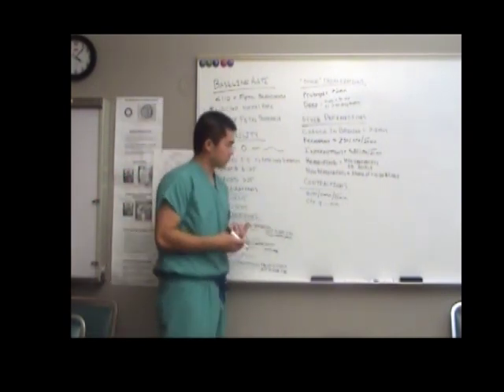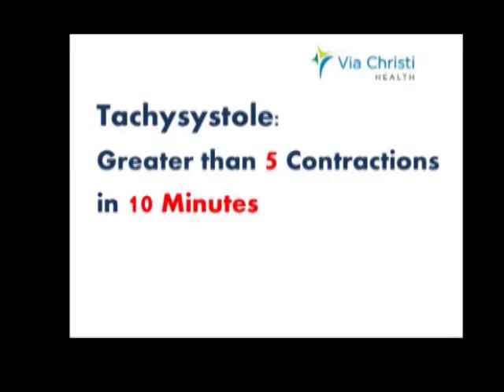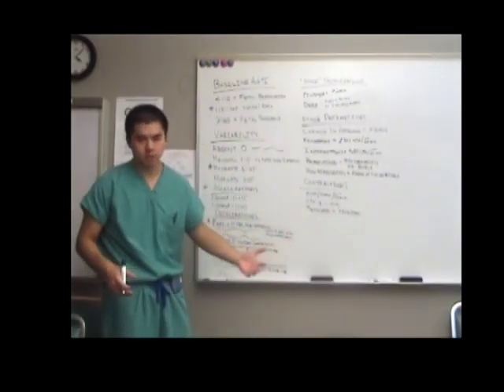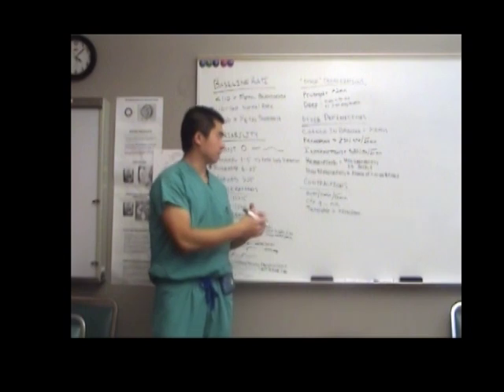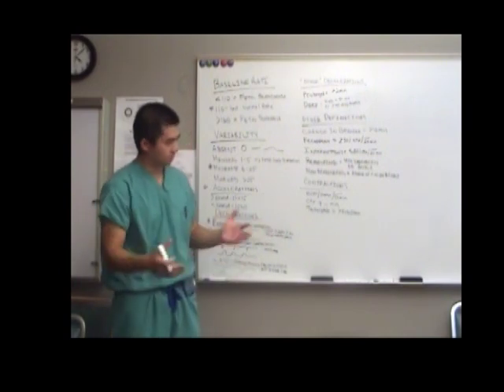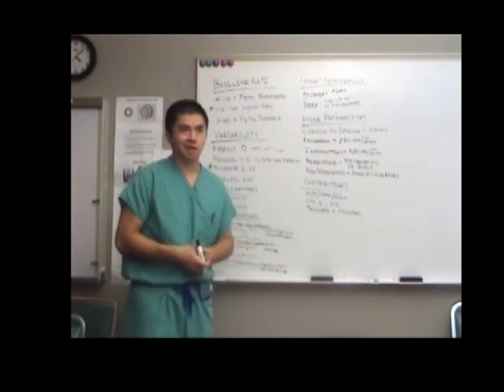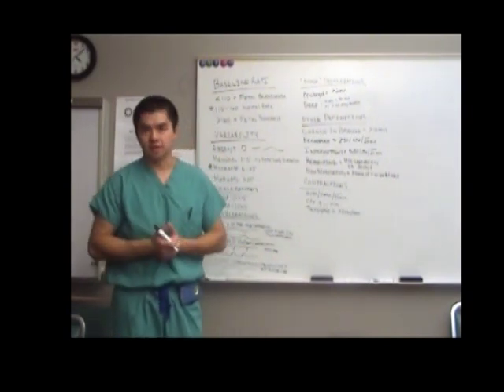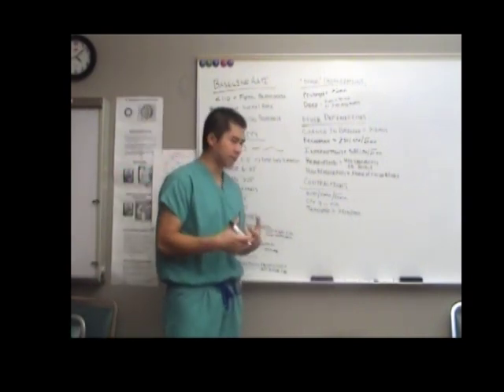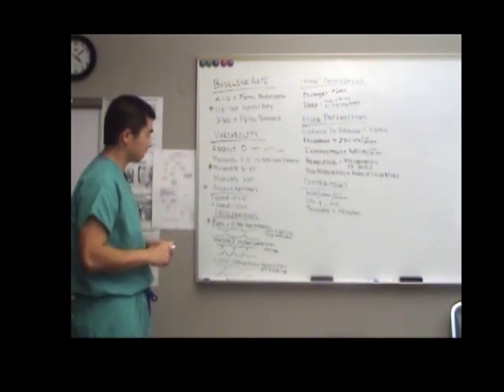So if you have too many contractions, what is that called? Tachysystole, which is defined as greater than 5 contractions per 10 minutes. Again, averaged over 30 minutes. But again, typically, like for recurrent and intermittent decelerations, we don't wait the full 30 minutes to determine whether or not something is tachysystole. You could say there's been 6 contractions in the last 10 minutes, which will make someone think that the tocometer is showing tachysystole. So now you have everything you need in order to describe a fetal heart trace.